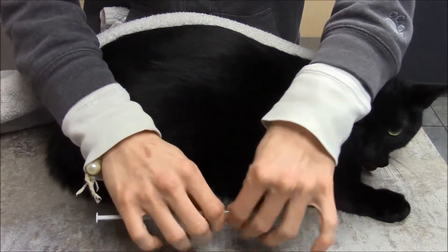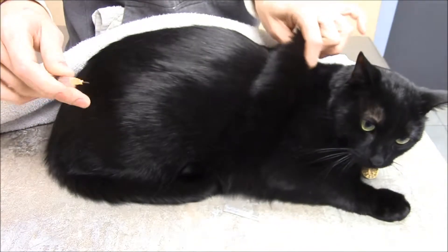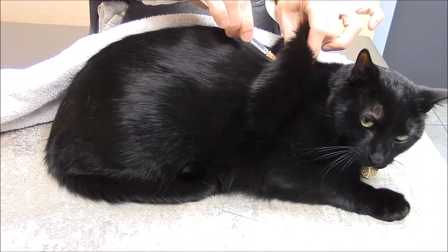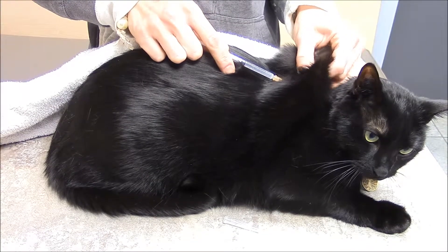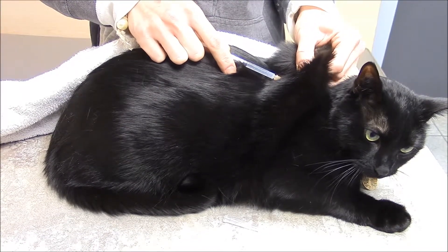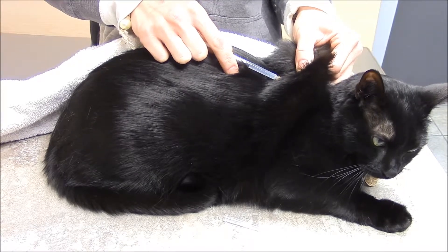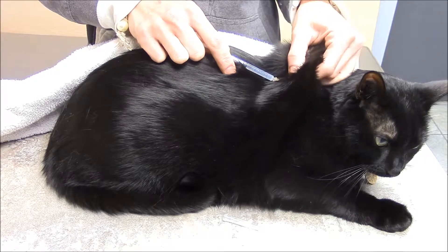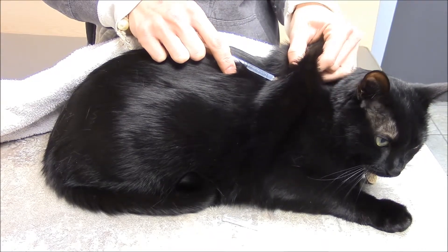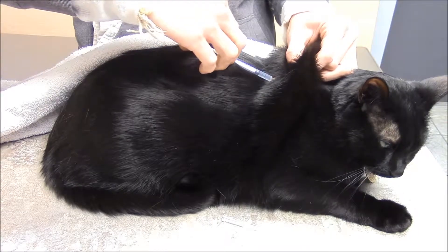I'm going to take the cap off my syringe and needle. I'm going to tent the skin. I'm going to insert the needle. I'm going to pull back on the plunger, and I'm checking for any blood that can flash back into the syringe. If there is, you want to pull the needle out, re-tent it at a little bit different position, and then reinsert the needle and give the injection.